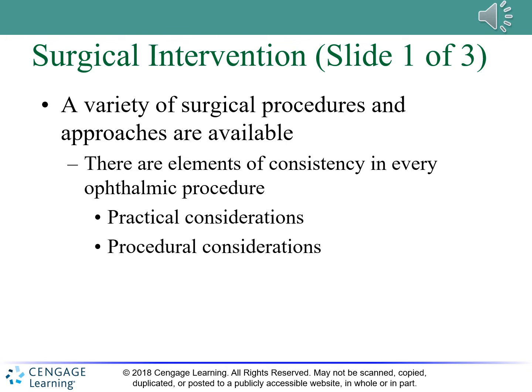Extra care should be taken to keep lint off the instruments in the sterile field to help prevent formation of postoperative granuloma in the eye. So again, if we have powder on the gloves or any lint, that could create that granuloma in the eye.